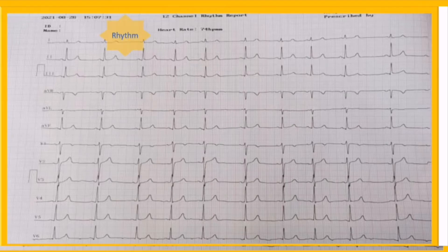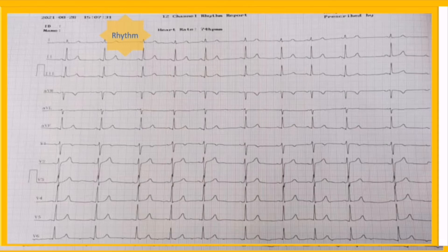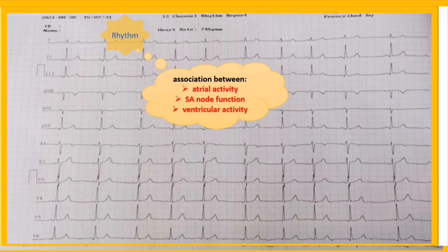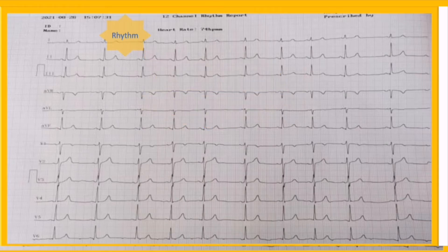The second step is cardiac rhythm. Heart rhythm analysis is the most important, sometimes most challenging, and most time-consuming step in EKG interpretation. Every heart rhythm results from the association between atrial activity, SA node function, and ventricular activity. The electrocardiographic definition of heart rhythm is the relationship between P waves and QRS complexes.